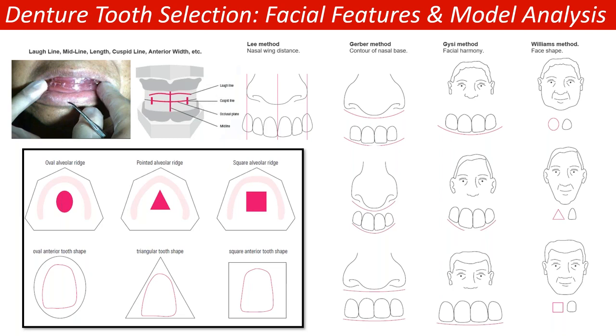But again, if you were to look at all of the prescriptions you ever received, you'll start noticing a trend from office to office, or even yourself, if you're a denturist, you're selecting teeth, and you're fudging a little bit on the standard, what we used to call the average selection of molds. You'll find that they're condensed. There's a very few select molds that we use. There's a very few select shades that we use. So just start looking at that so that you capitalize on what you know from each individual dentist. Have them start taking shades that you want them to take.